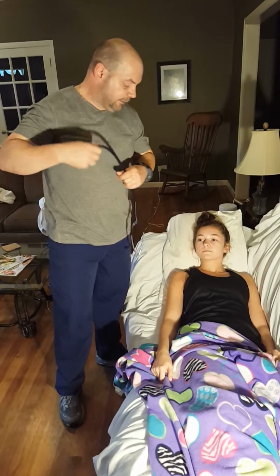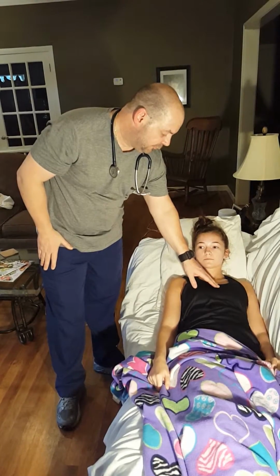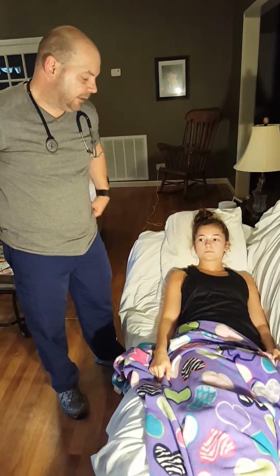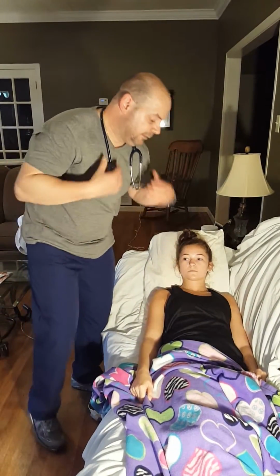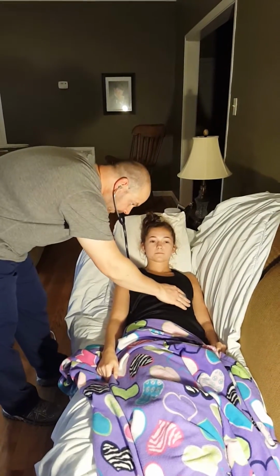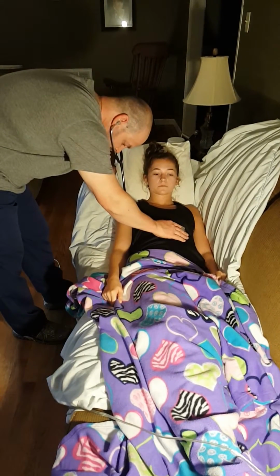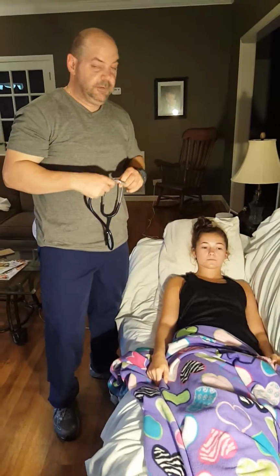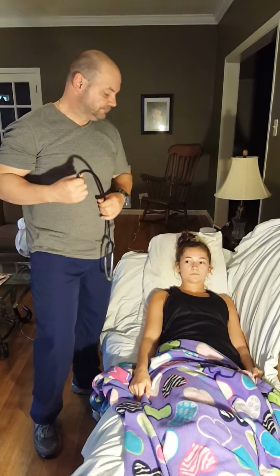Everything sounds fine. Once we've auscultated the aortic, the pulmonic, Erb's point, the tricuspid area, and the mitral area, we want to find our S1 and our S2 sound. So again, we're going to auscultate right here in the mitral area. And the S1 and S2 are very distinguishable, the S1 being the lub, S2 being the dub.